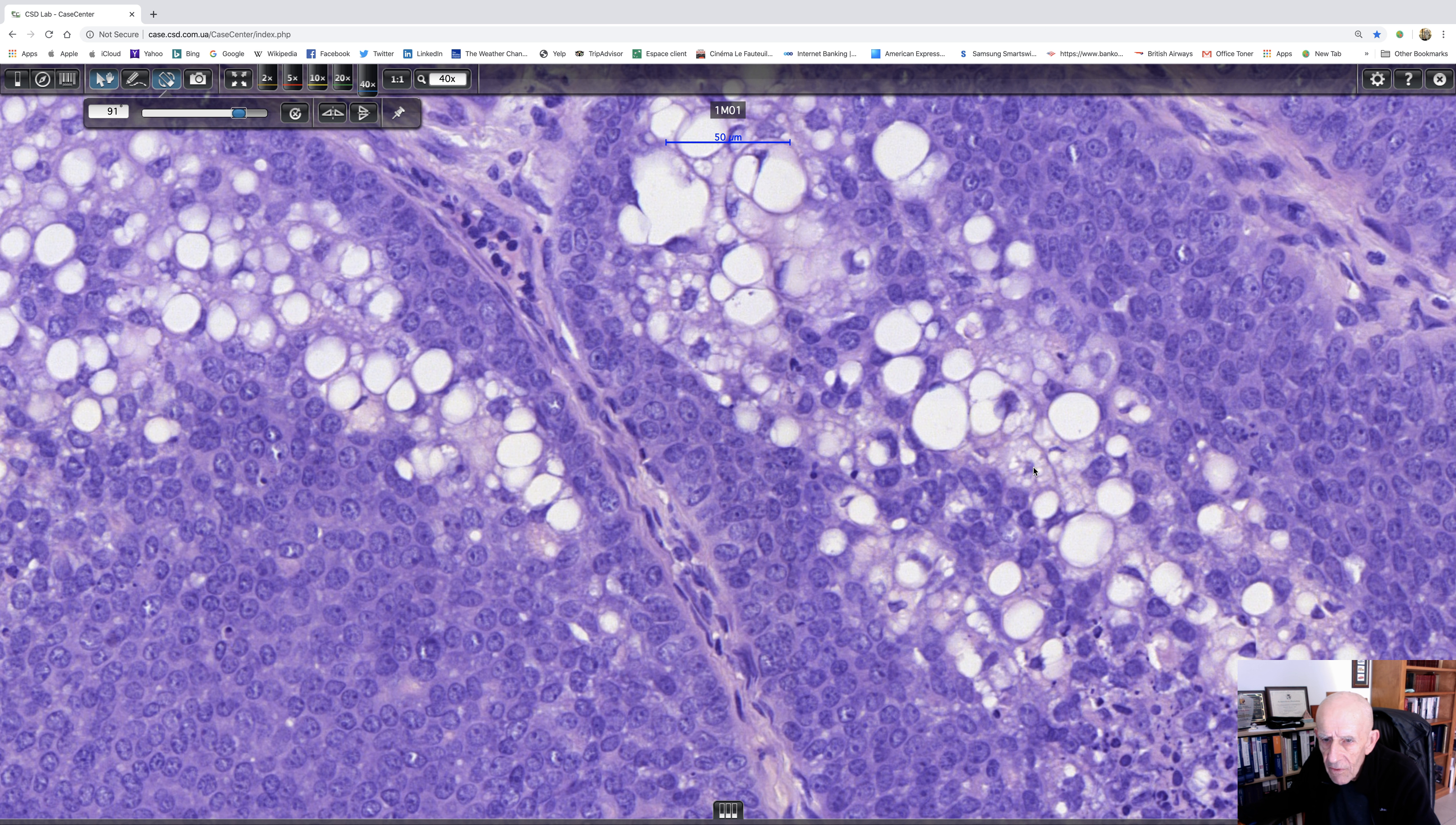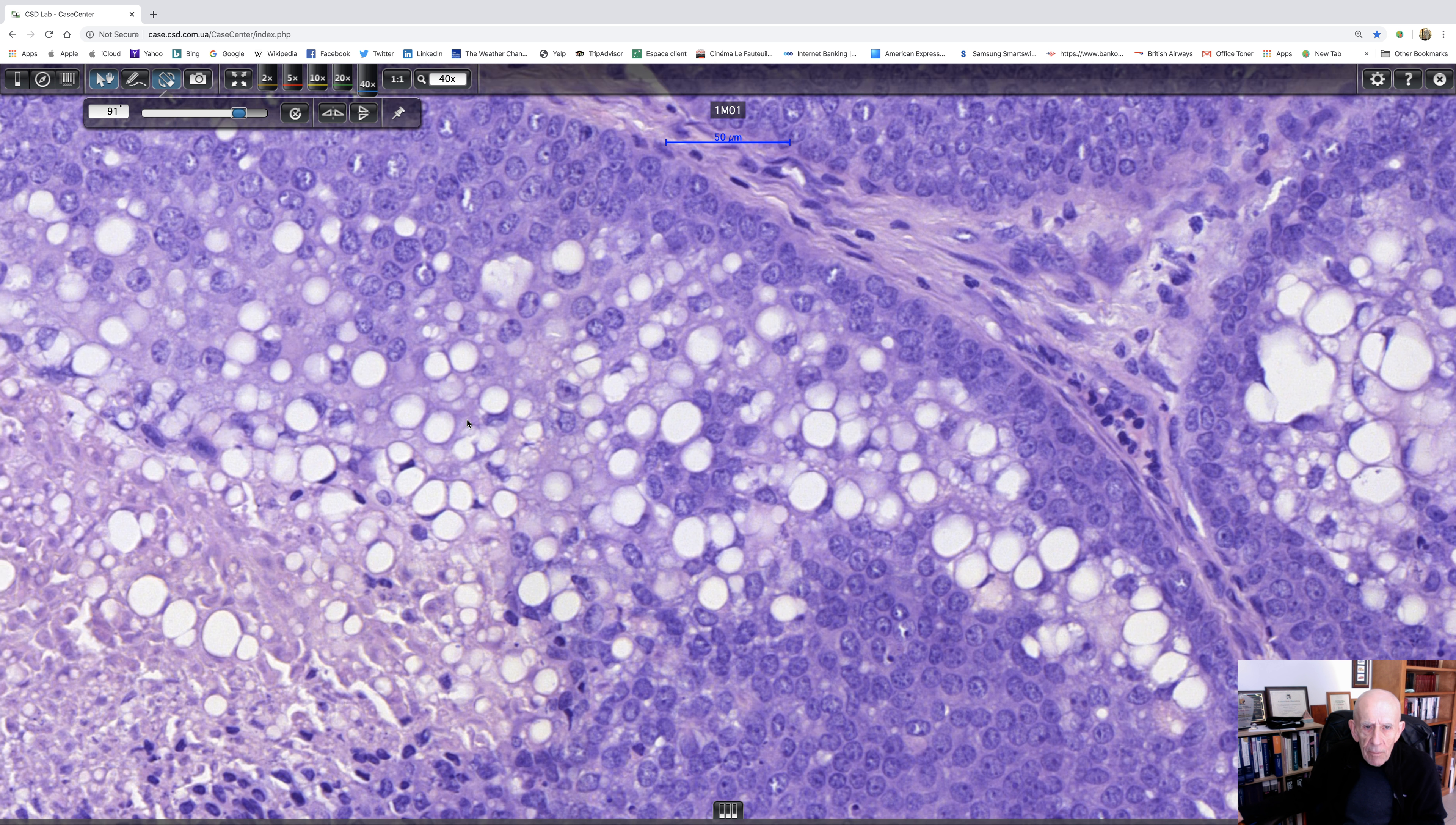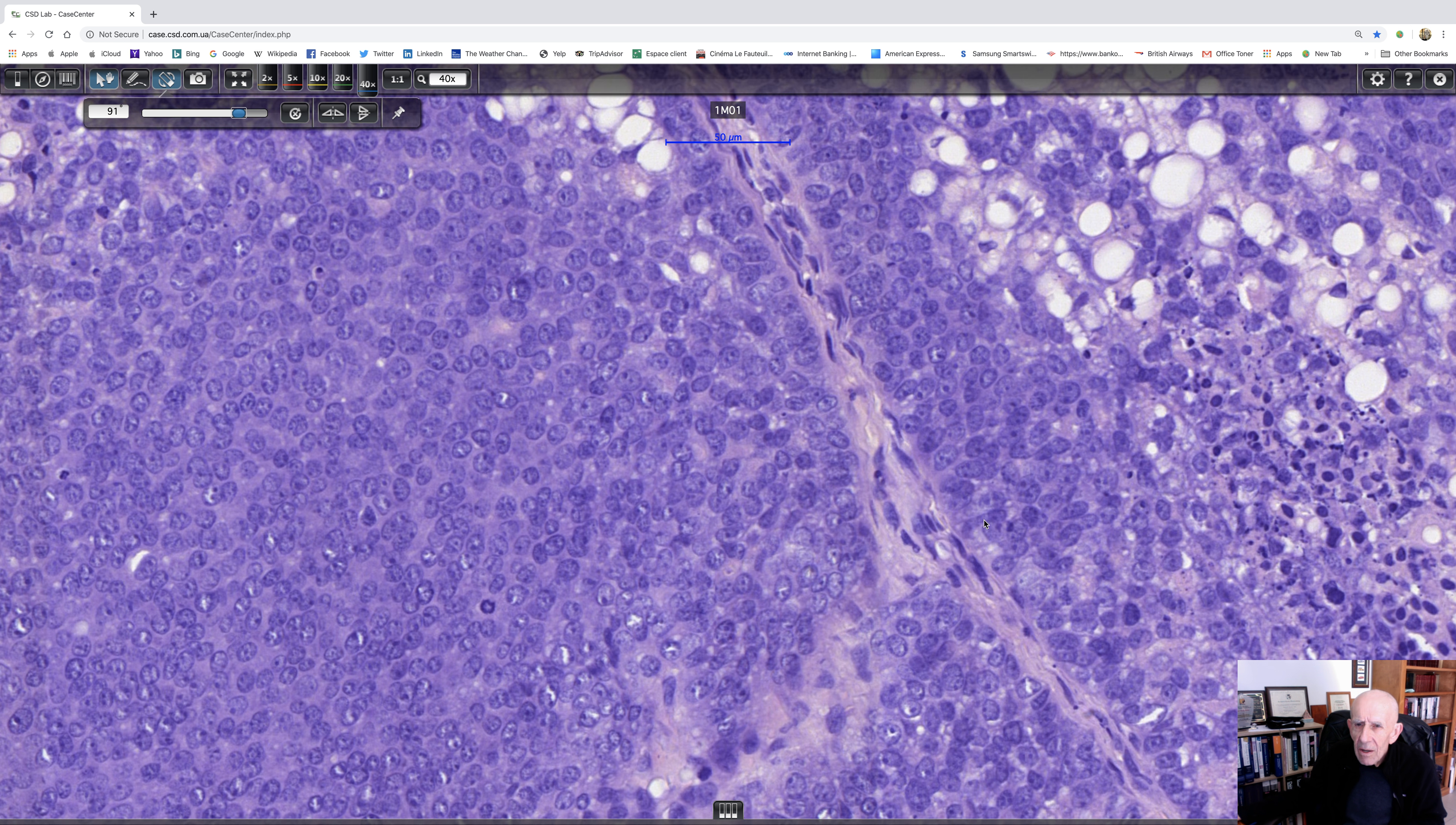And in fact, there's another one there. And the vacuoles are very variable in size and shape. There are little tiny ones round there and some there. Sometimes, obviously, these vacuoles have coalesced to give rise to a signet ring cell appearance, which obviously, in a different context, would make you think of intracytoplasmic lumina and that sort of thing. But we've got clear sebaceous differentiation that I just showed you. So I don't think the diagnosis is really a problem. And there's a nice mitosis there.